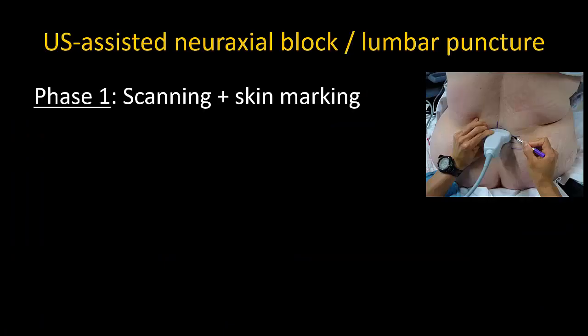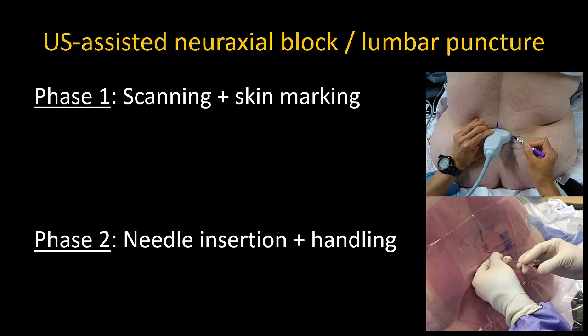As with any ultrasound-guided procedure, there are two phases. First, scanning to identify the relevant anatomy, and in the case of spine imaging, marking the location of landmarks on the skin. Second, needle insertion guided by these landmarks with appropriately careful needle handling to ensure that the needle goes where you intend it to.